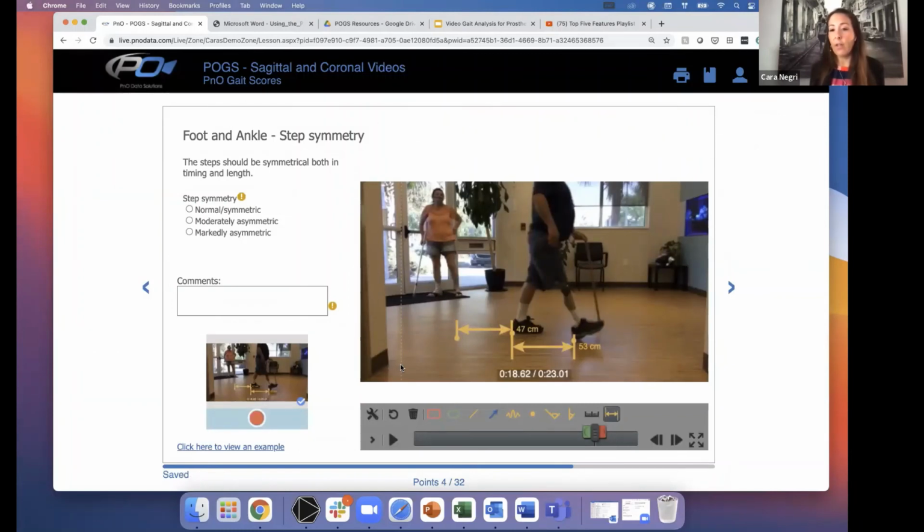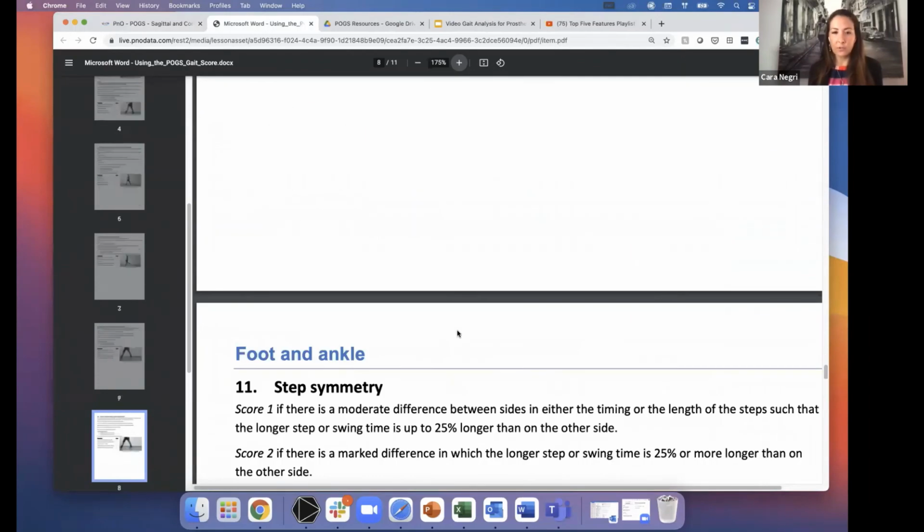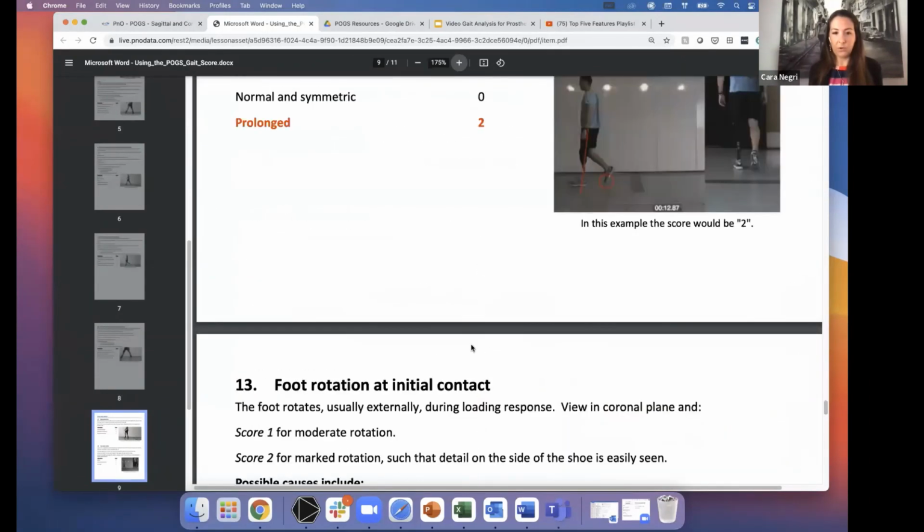He feels like he's going to fall out. So he doesn't have any stabilization at the hip. So he's trying to get off of it as quickly as possible. And that's stuff that I can put into these notes as well, so that I can send over to the doctor.